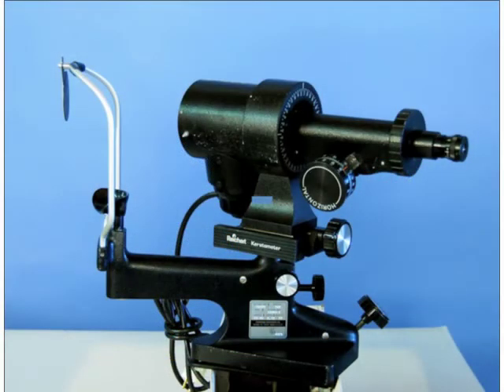When we think of measuring the shape of the cornea, we generally think about things like using the keratometer. And even though I'm going to be presenting different means of measuring the shape of the cornea, the keratometer is really important clinically because we use keratometric readings for things like contact lens fitting, and especially for things like calculating the appropriate intraocular lens power.